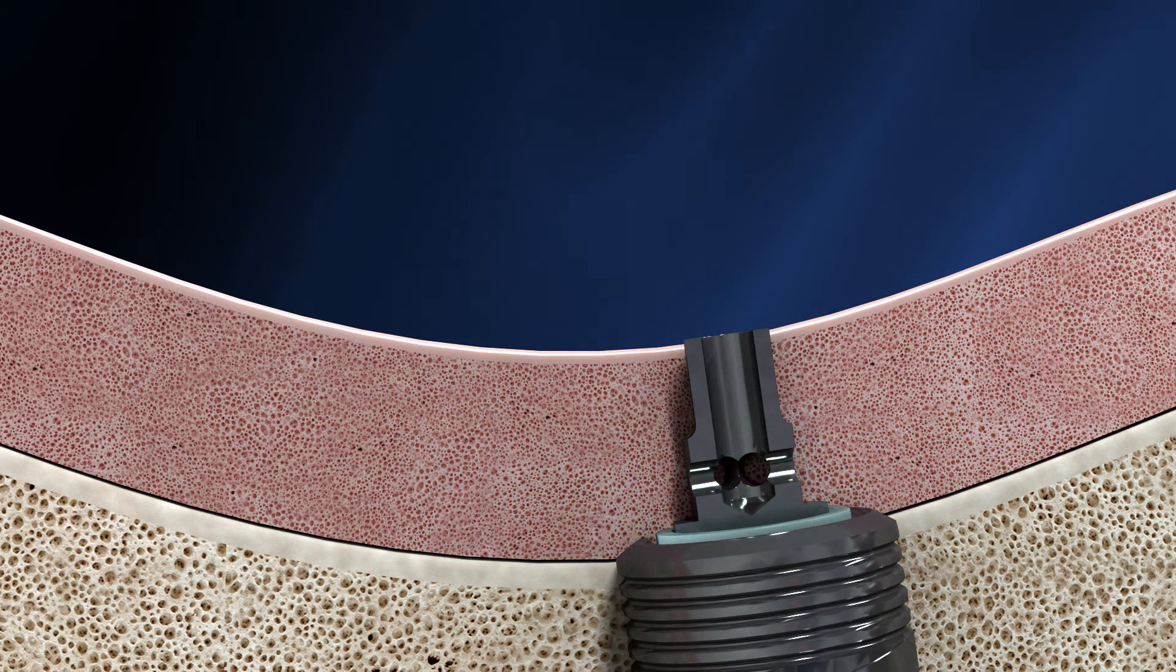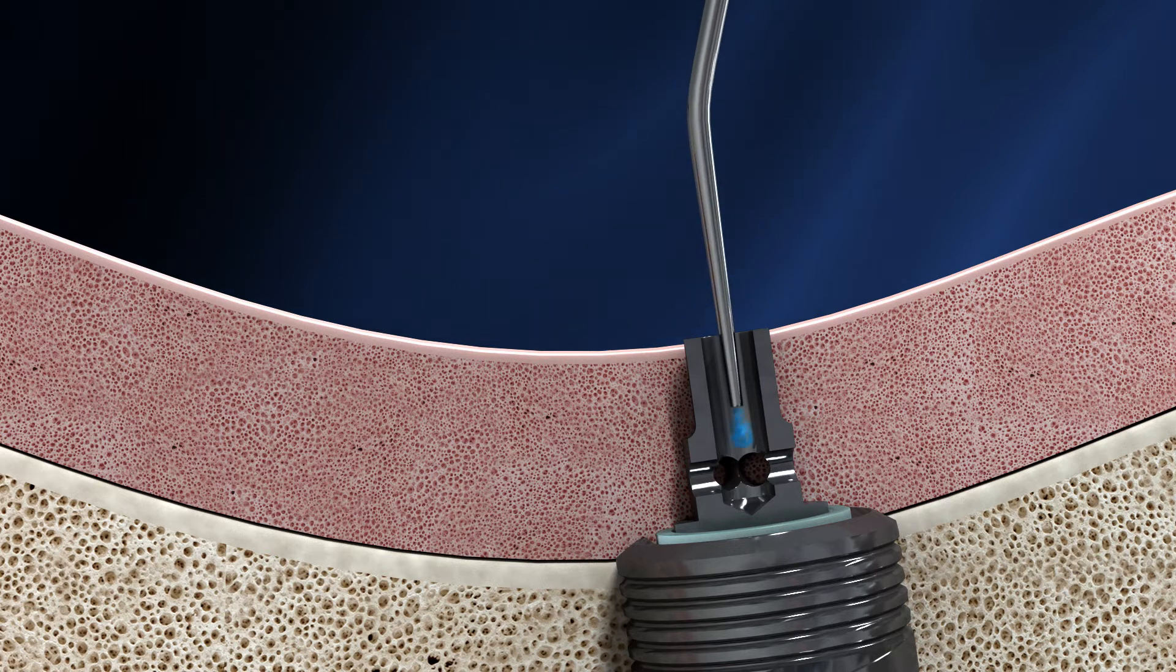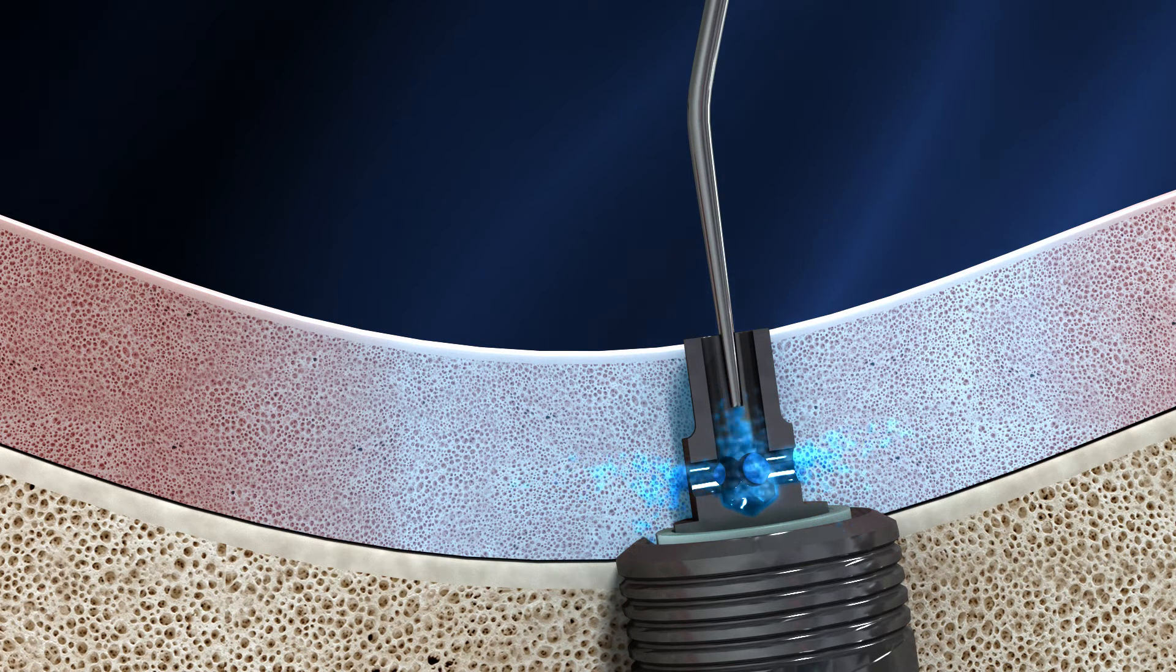When it's time to uncover the implant, use the irrigation tunnel to inject the anesthetic solution without inflicting any pain to the patient.